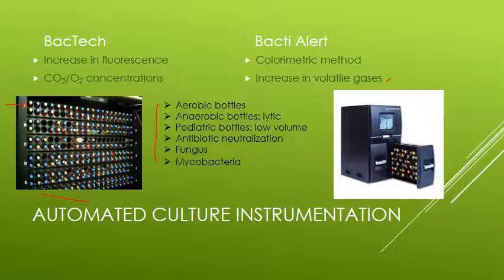And then also you need a whole other bottle. Although most fungus can grow in your routine anaerobic and aerobic bottles, if you're specifically looking for fungus, and remember, fungus you keep for a very long time. So the longer you keep a blood culture bottle in there, the more likely it is to grow something, which would be skin flora associated with phlebotomy. If you really do want to keep a fungus bottle for 4 weeks, you should use a specific fungus blood culture bottle so that it can inhibit the growth of normal bacteria.